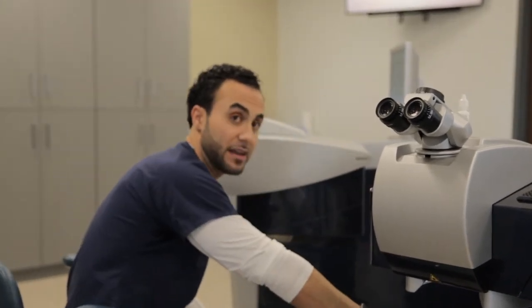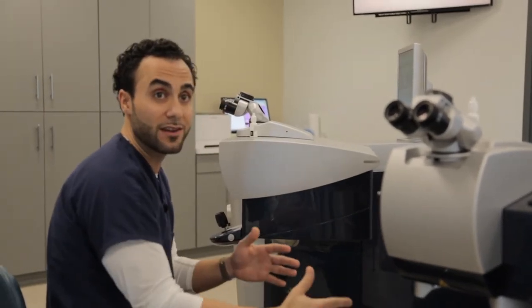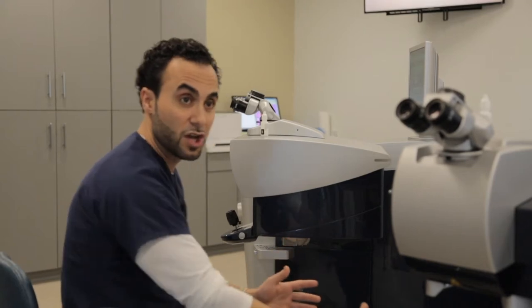So what we're about to do here with Daniel is a bladeless LASIK treatment. What it involves is two lasers — it's actually a two-step procedure. We're going to first take Daniel into the room, my assistant will sit him down on this bed face up. The bed swivels between the two lasers, so Daniel doesn't have to get up at all. We swivel the bed over to the left — this is the femtosecond laser, which gets the eye ready for the treatment that removes the prescription for glasses.